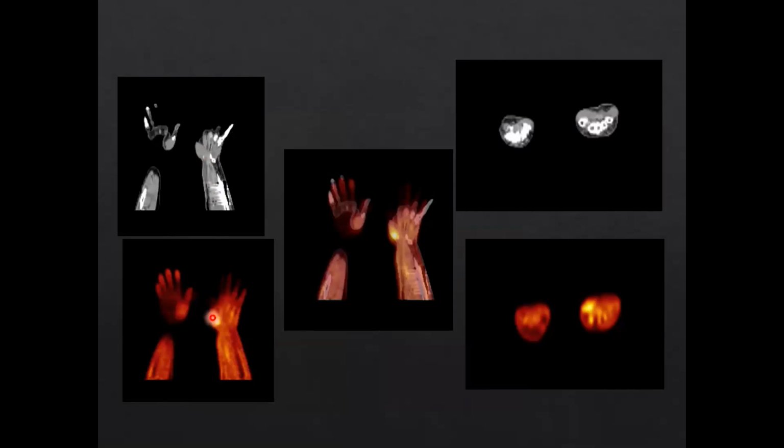And this is a case where the focal area of the thenar muscles is involved, with a non-specific uptake which still has good SUV values. It was roughly around 5 SUV max. So even though it is not a malignant entity, this sort of lesion will cause confusion in the evaluation of routine things. So we should always have a dictum of following the protocol to diagnose certain things, and if they are not, then the unusual things come later.